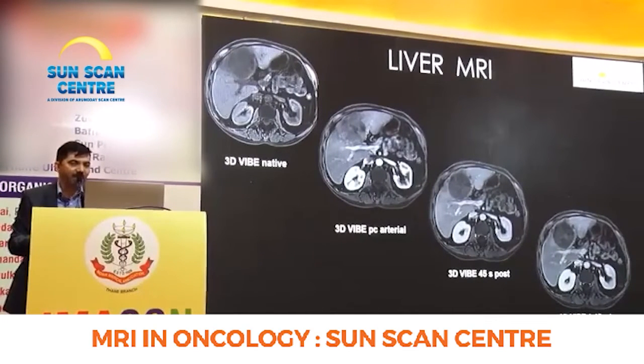And now in contrast MRI, we have an arterial phase, we have a venous phase, we have a delayed phase. And the big advantage with MR is that the contrast stays in the liver and the area of interest for a fairly long time, and you get good amount of time to evaluate that. And at the same time, you have contrast enhancement of all structures in the abdomen, so you can evaluate all structures in the abdomen at a given time.